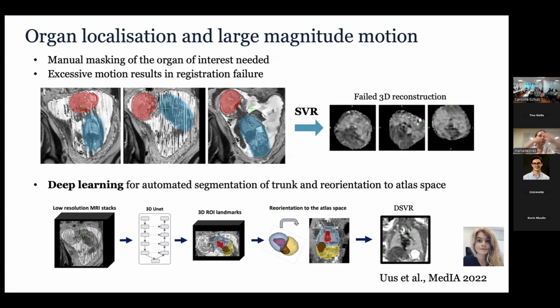It also depends on how you acquire your data. We have several passes in a stack, so we split them into packages, but if you just have a clinical scan of 6 slices, it will be all ascending. If they're all ascending, the baby wouldn't have had so much time to move, so the 3D information is quite good, and if it's not, usually it's broken.